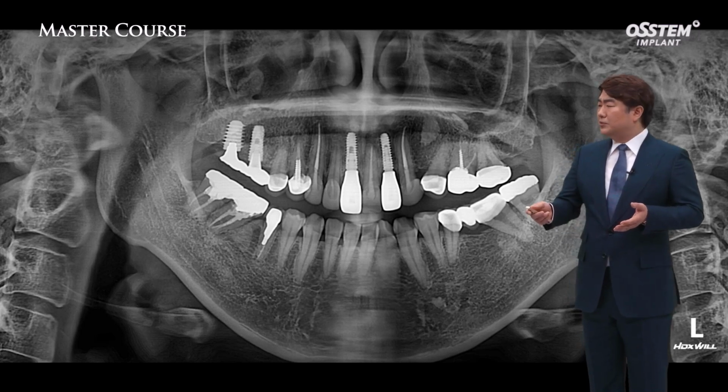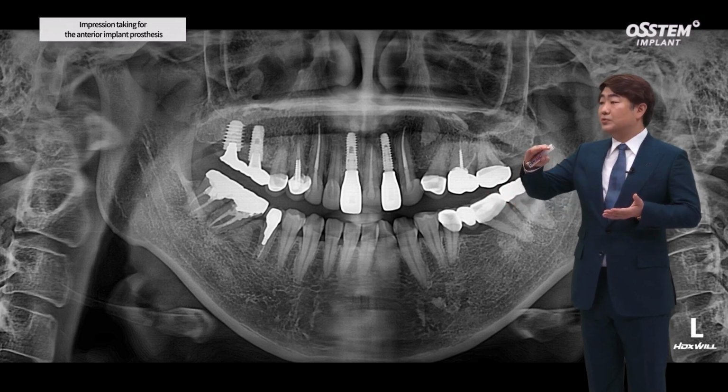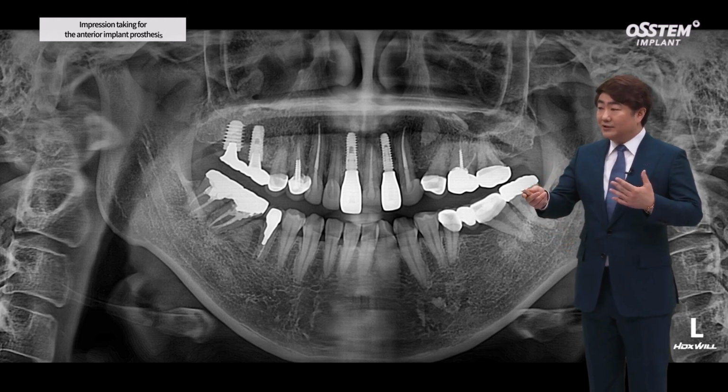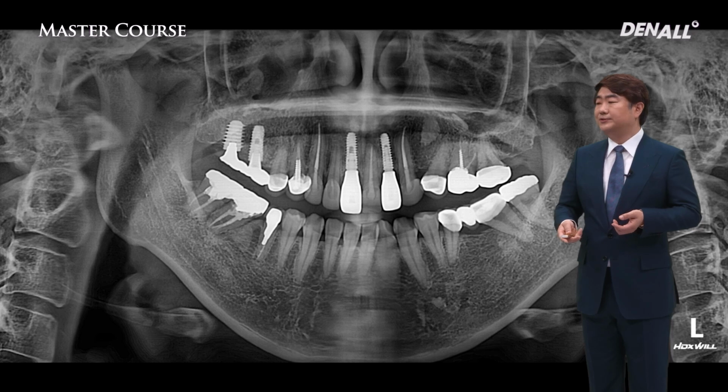And after delivery, as you can see in number 22, the gingiva margin, compared to the initial visit, seems to have quite collapsed. And number 11 also seems to have a bit of a collapse compared to the adjacent teeth. You see a bit of recession, but number 22 is more collapsed.